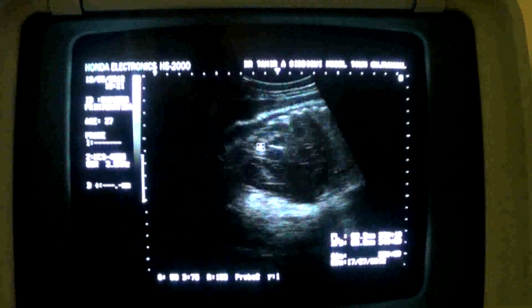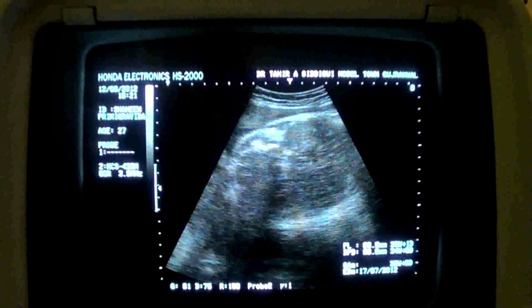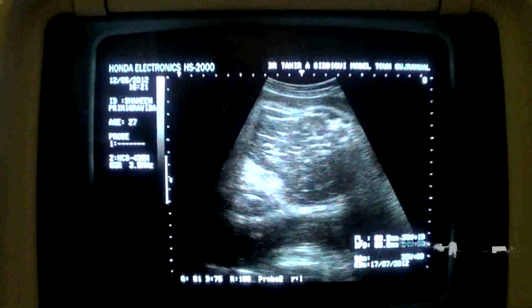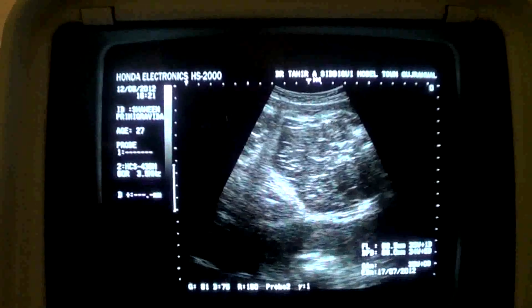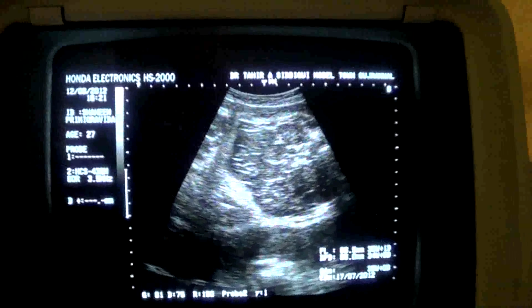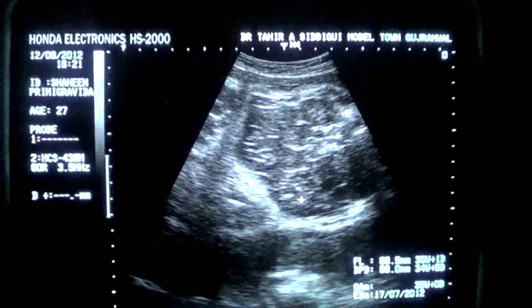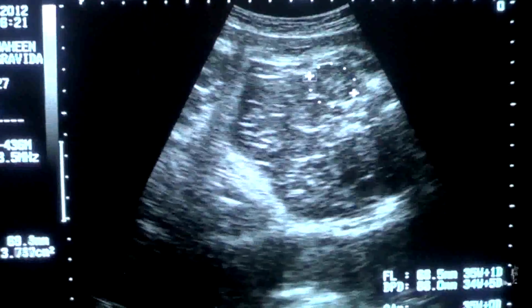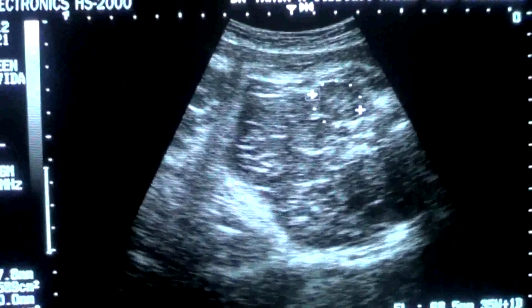First I will try to get you the normal. Now see, concentrate on this area, it's not giving a normal appearance. There is absolute distortion of all the abdominal organs, if you see. However, you can see this is the kidney. This is the kidney in the fetal abdomen. And these are the kidneys in transverse section. This one and this one.